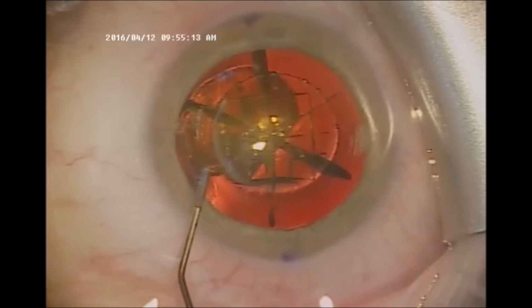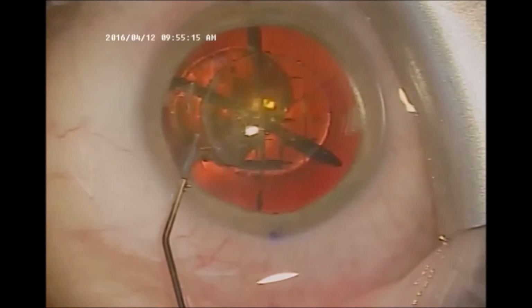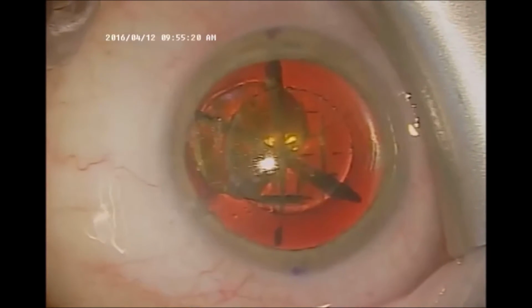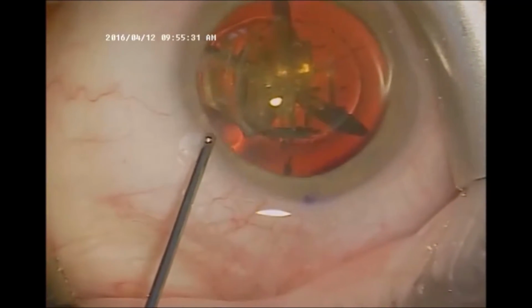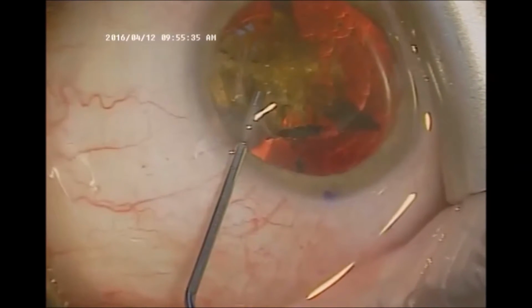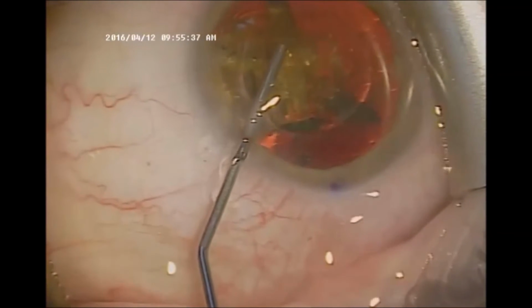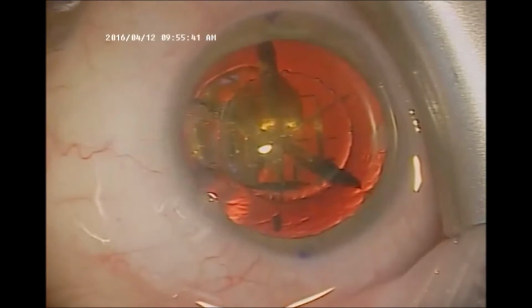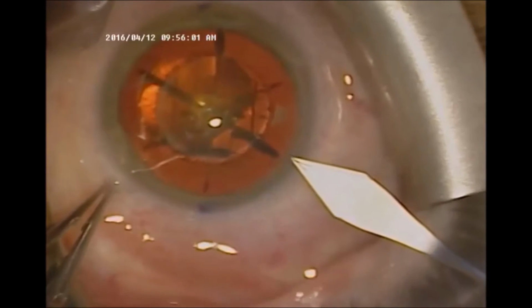Here we inject numbing medication or preservative-free lidocaine into the eye in order to keep the eye dilated as well as to keep the patient comfortable. Here is viscoelastic in order to keep the eye formed during the remainder of the procedure. The patient may experience a kaleidoscope of colors at this point.